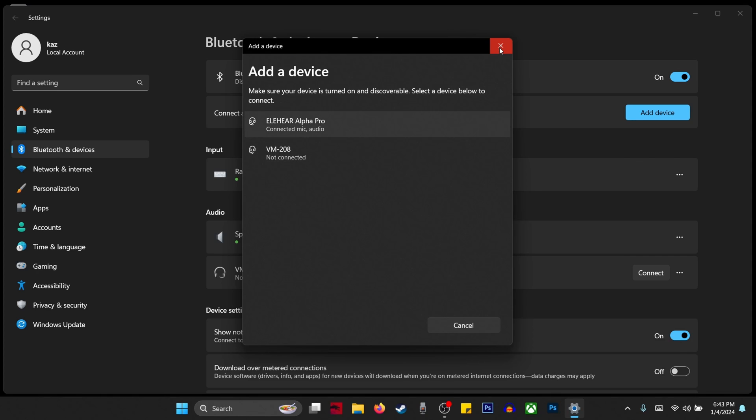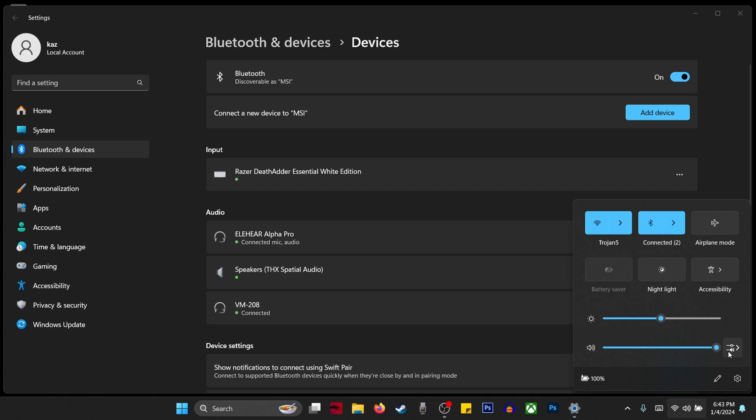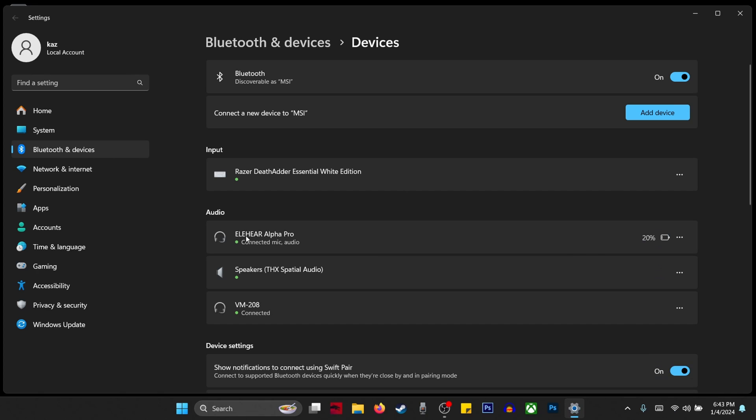Any sound that comes through the computer will now come through these hearing aids — it is streaming. And remember: if your hearing aids do not show up, make sure they are not connected to something else. If they're connected to your phone, shut off Bluetooth or unpair them from the phone. And if they still do not show up, then for whatever reason they're probably not compatible.